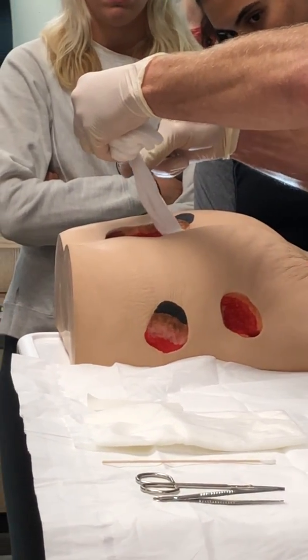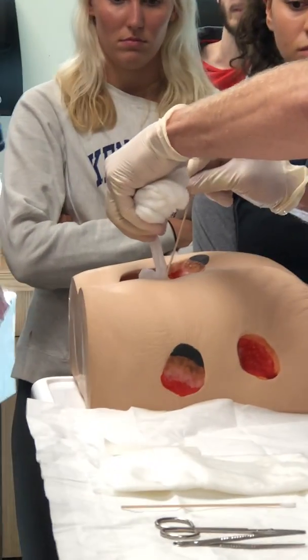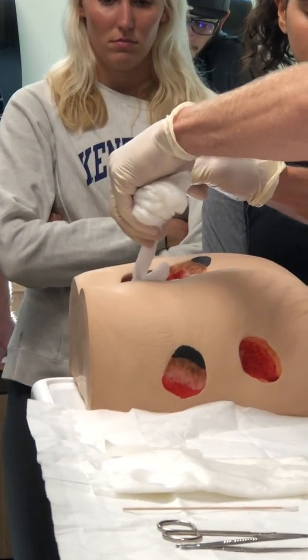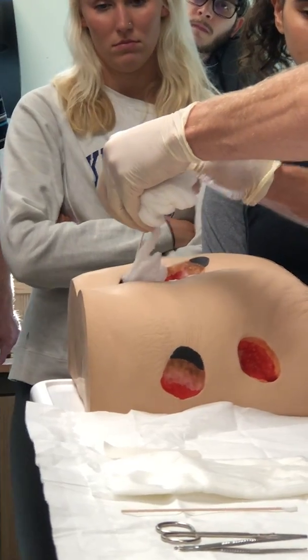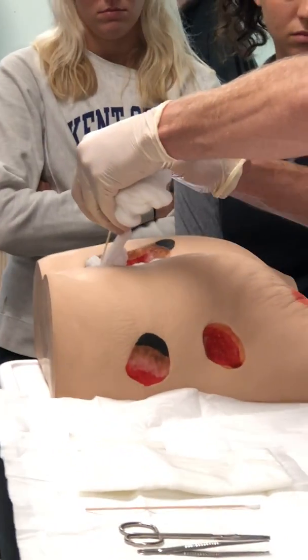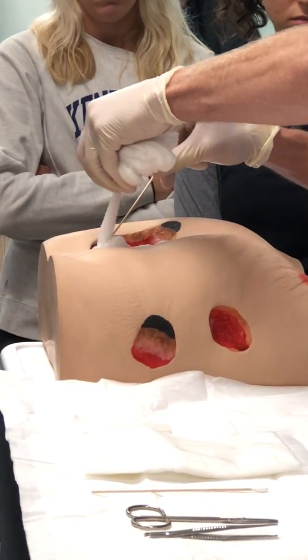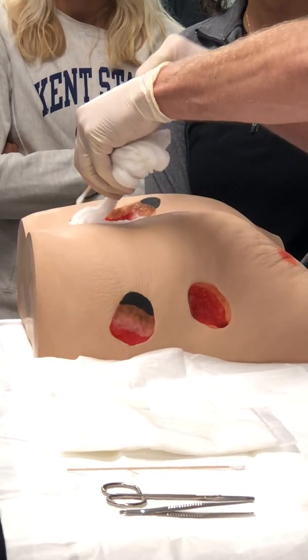You want to loosely but fully pack the wound. It is a pressure ulcer. If you pack it too tightly, you are creating pressure on new capillaries. So you do not tightly pack the wound. You pack the wound fully to the top edge of the skin, but not beyond that. So loosely pack, but fully pack. Does that make sense? You do not want to be putting extra pressure on new capillaries.